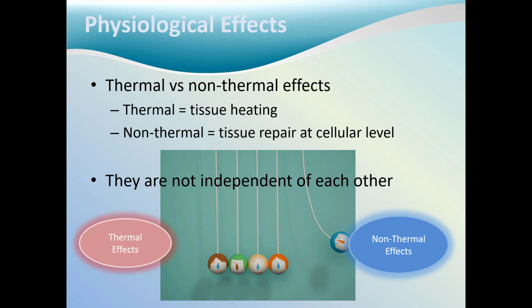Both thermal and non-thermal ultrasound produce physiological effects. The primary purpose of thermal ultrasound is to increase tissue temperature. The clinical effects of thermal ultrasound include, but are not limited to, increased extensibility of collagen fibers in tendons and joint capsules, reduced viscosity of fluid elements in the tissues, decreased joint stiffness, reduced muscle spasm, diminished pain perception, increased metabolism, and increased blood flow.